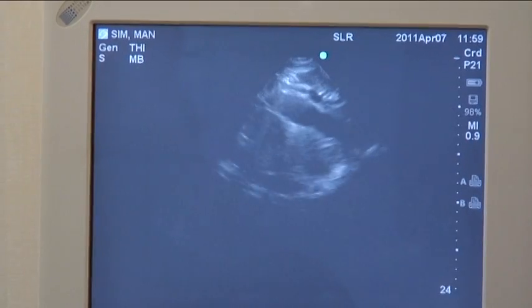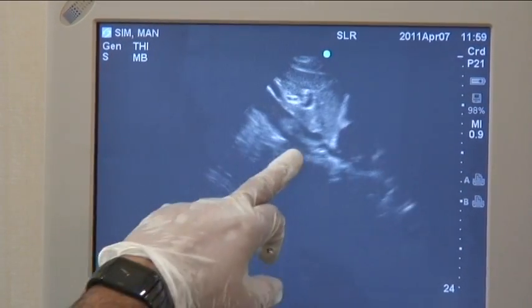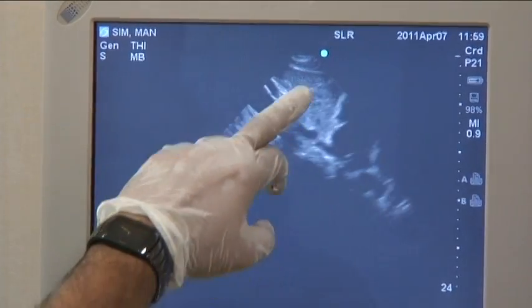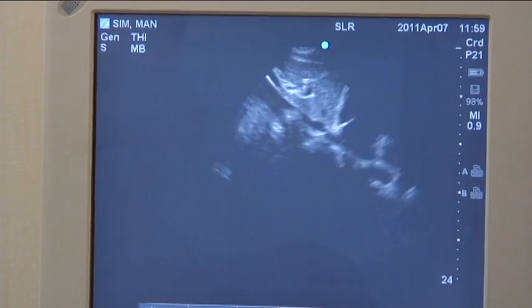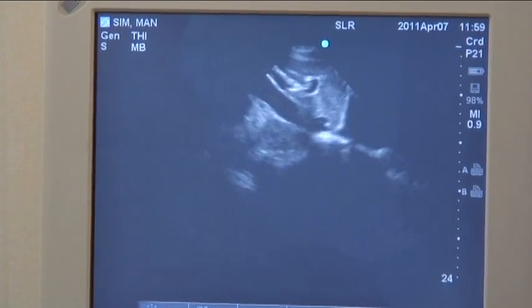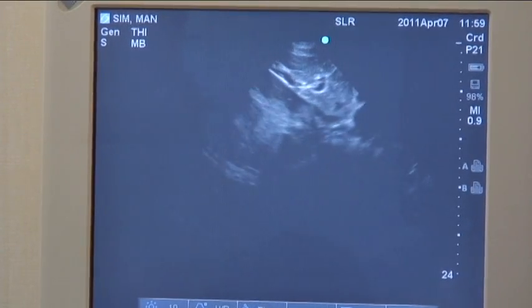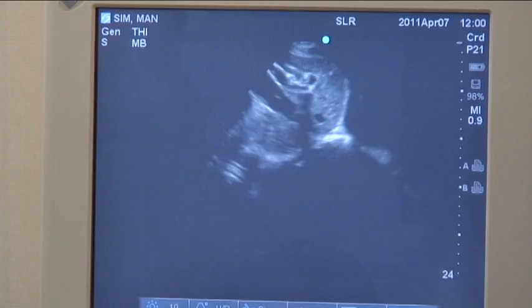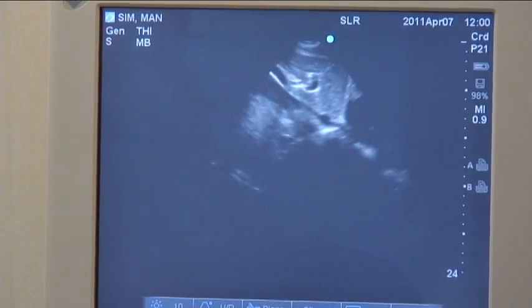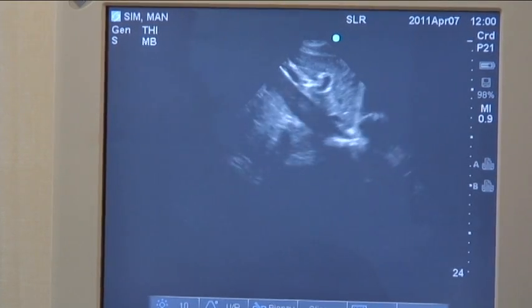Now, one way to identify the IVC is you go up a little bit, you show it entering into the right atrium very nicely here, and you see this hepatic vein here. Now, obviously, James has been maintaining a very good fluid intake. His caliber is nice and full, which is an indicator that he is adequately fluid replenished, so to speak.